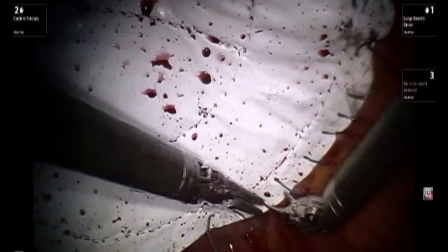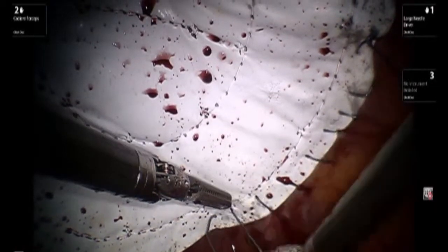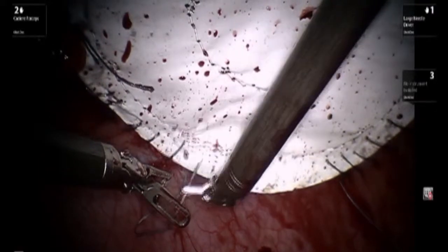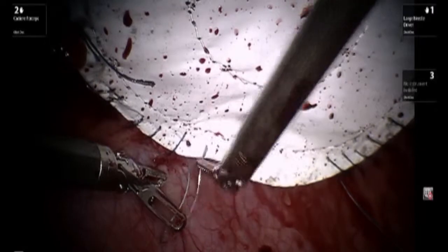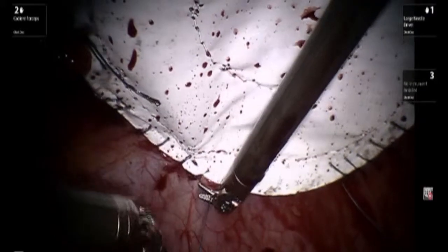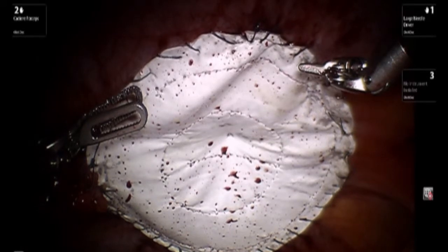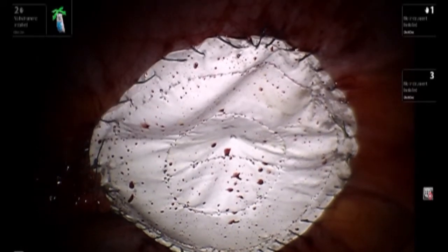One of the main advantages of utilizing this approach is that one doesn't have to use a tacker, and this helps save a significant amount of money. In addition, while it's only anecdotal, it appears that patients have significantly less pain after this suturing approach as opposed to having 25 to 30 tacks going through the peritoneum. This is the completed view — thank you for your attention.